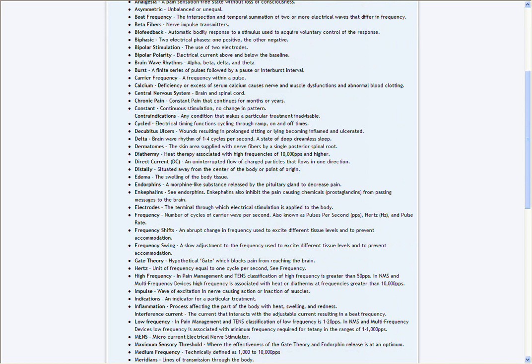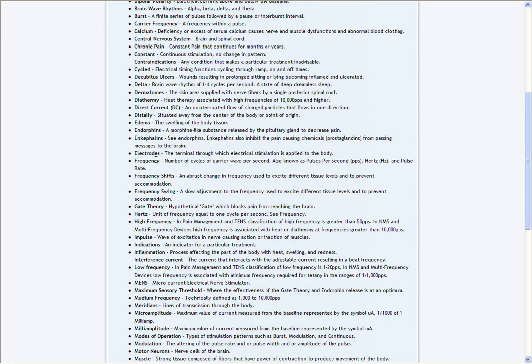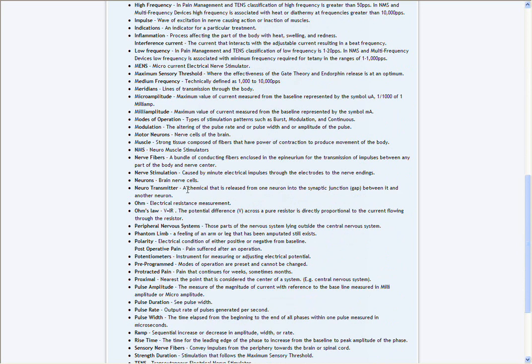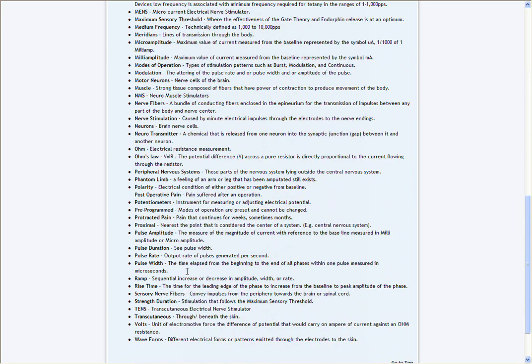The frequency, it's the number of cycles of a carrier wave per second, and you have to be pretty specific to do muscle contraction with the muscle stimulation device. But your physician or therapist is going to be very knowledgeable about this. A little bit about nerve fibers, transmitters. The pulse amplitude is the measure of the magnitude of current with reference to the baseline. So that's the dials that increase it.